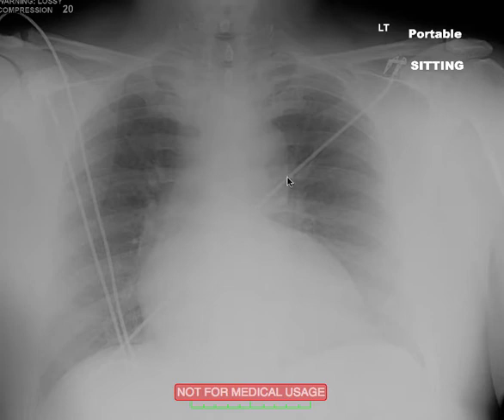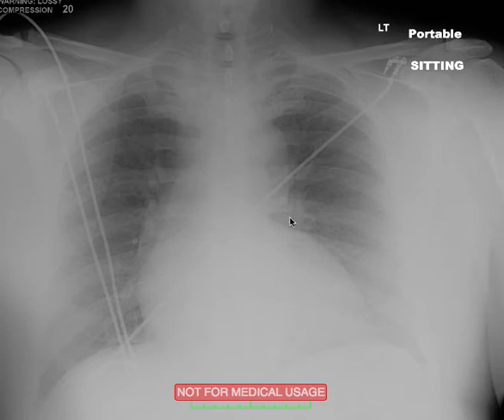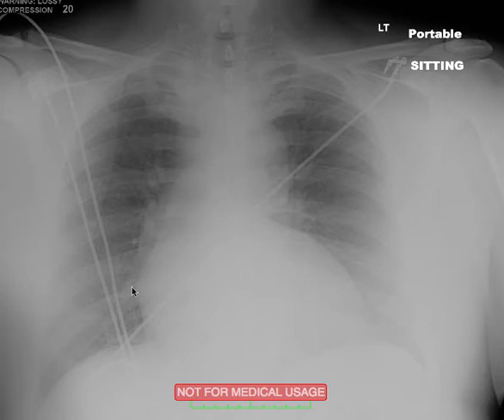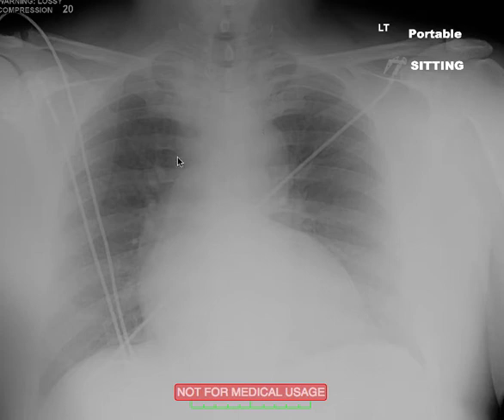You always want to evaluate the mediastinum, not just the heart size, but see what you can in the mediastinum. What you can see is a portion of the thoracic aorta. You see the distal aortic arch here and the descending thoracic aorta. The other mediastinal contours represent different structures, but you cannot see the detail you can on a CT. Overall this looks like a big heart and I don't see any obvious mass in the mediastinum, so the mediastinal silhouette, except for the cardiomegaly, is pretty unremarkable.